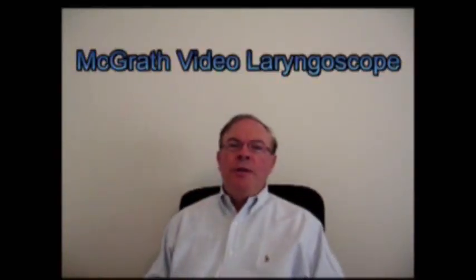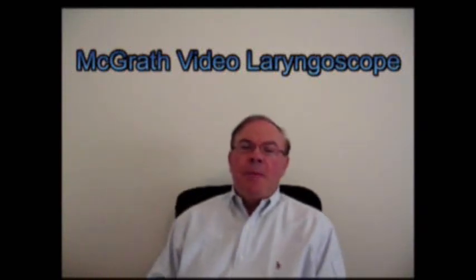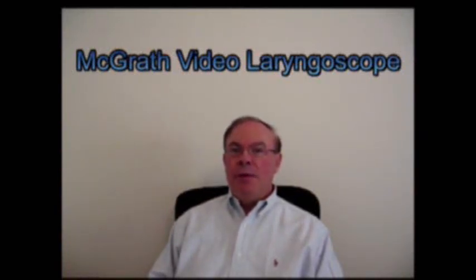Hello, I'm Dr. John Doyle from the Department of Anesthesia at the Cleveland Clinic, and today is October 2nd, 2006. I'm going to be talking to you for a few moments about the McGrath video laryngoscope, which I have here to demonstrate to you. Later on, we'll be taking you to the operating room where you'll be able to see a clip of the McGrath video laryngoscope in action.